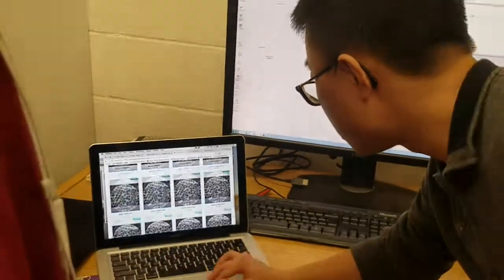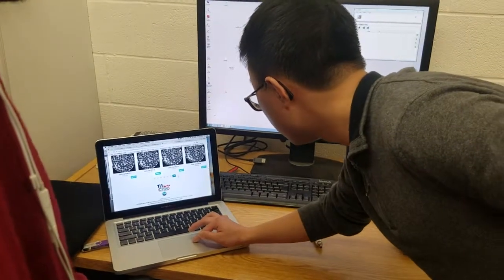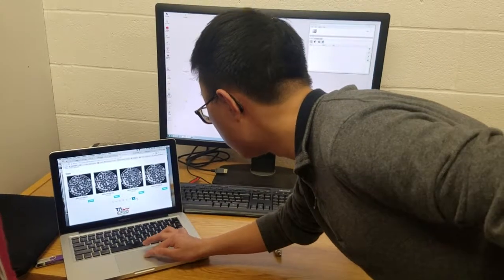If you click one image and go to the very end, this one doesn't have it. You can have two ways to do it.